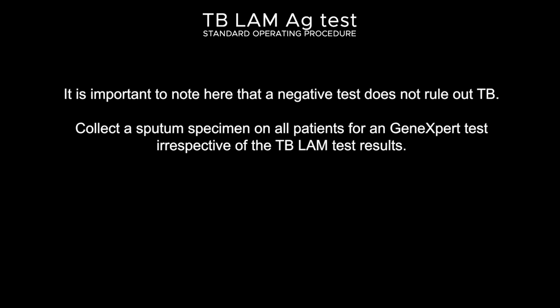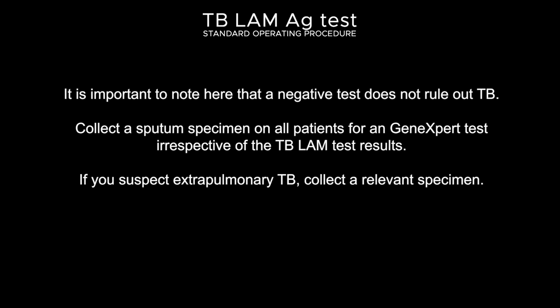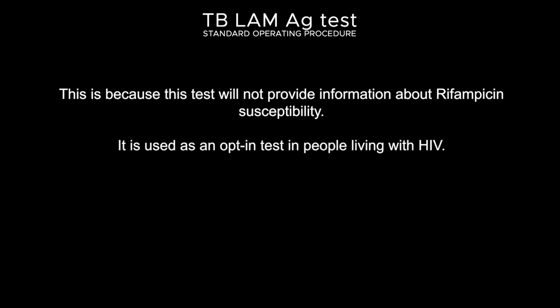Collect a sputum specimen on all patients for a GeneXpert test irrespective of the TB LAM test result. If you suspect extrapulmonary TB, collect a relevant specimen. This is because this test will not provide information about rifampicin susceptibility. It is used as an opt-in test in people living with HIV.